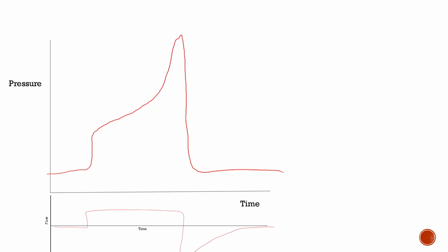I'll say it's not as straight. So I would assume that the inspiratory part of it was cut short. Are you speaking about the flow down here? Yeah, you're talking about this, the steep? Yeah. Oh, okay.